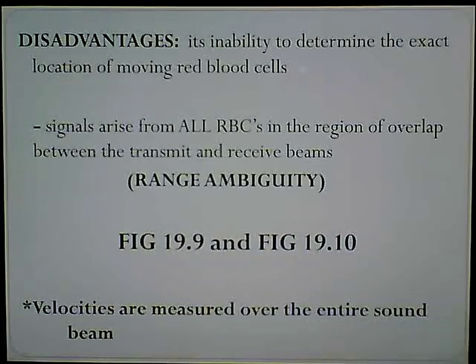Figure 19.9 and figure 19.10. The velocities are measured over the entire sound beam. We just don't get to be selective. That's all.